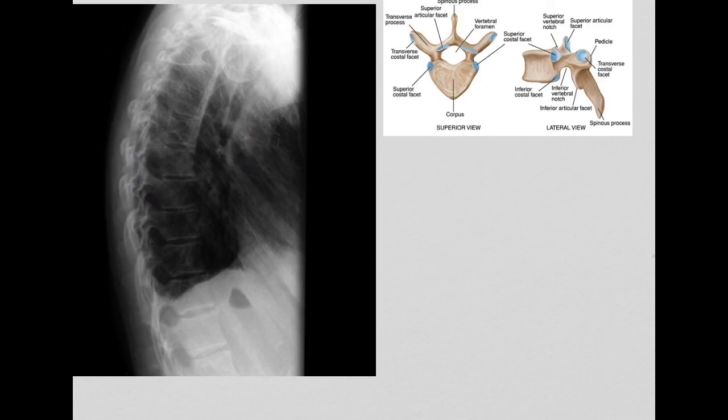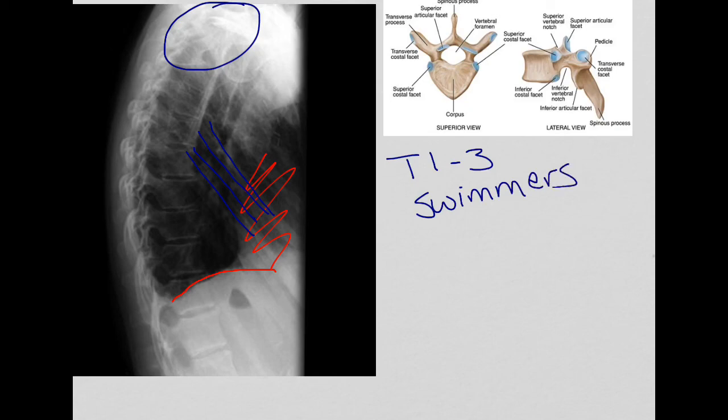Of course, you've got your superimposed hemidiaphragms. You've got heart shadow through here. You've got ribs running down this direction. You're not going to get a good look at T1, 2, or 3. T1 through 3 are not very visible on this projection. Therefore, you would need to do a swimmers if that was your area of interest.